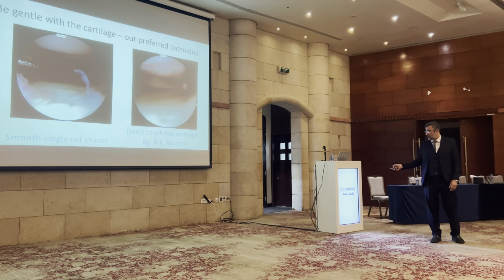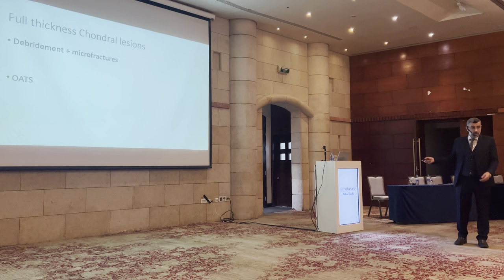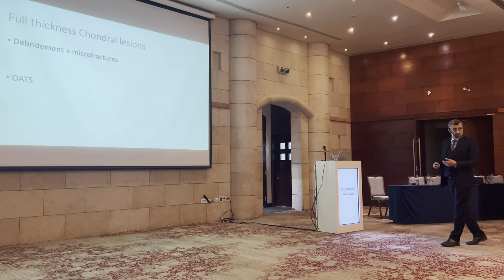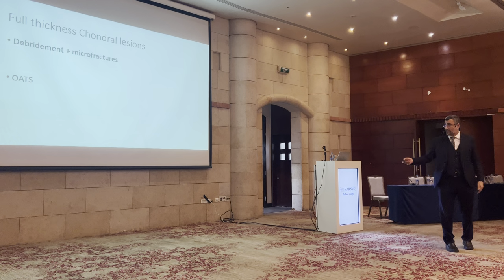So don't burn, don't touch, and don't burn the cartilage. So it was 5 minutes to debride and do the heat control test. There was 40 to 60 minutes of unnecessary work of burning of the cartilage. So don't touch the cartilage, don't burn the cartilage.